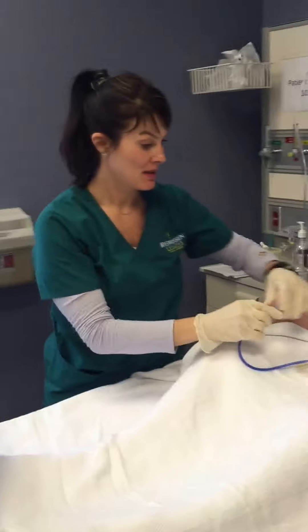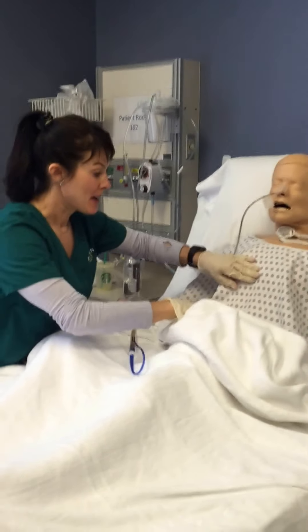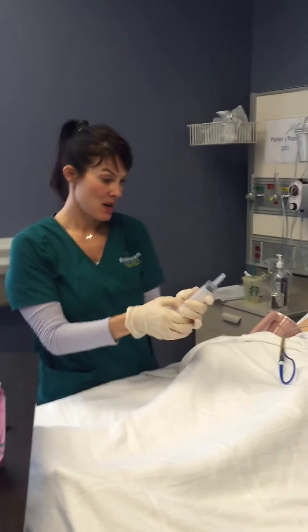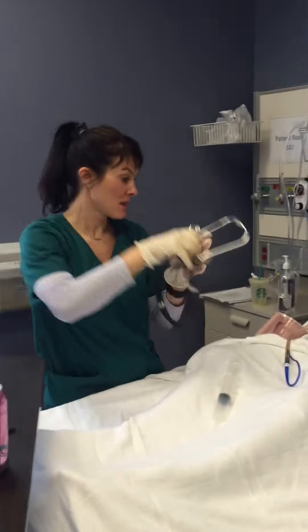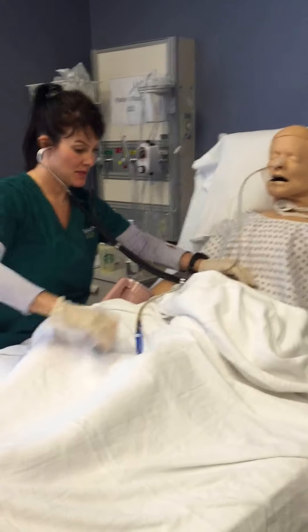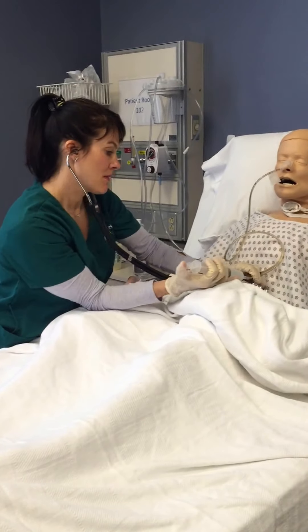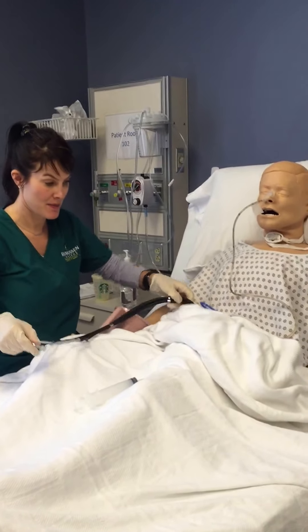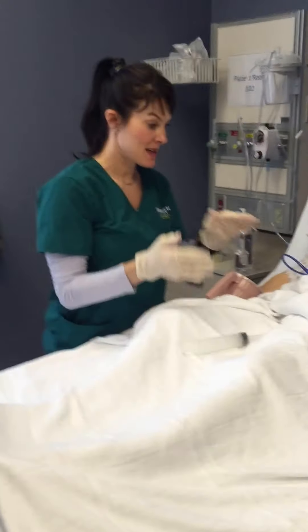After I do that, I'll put this back. X-ray is coming — they're going to take an X-ray to confirm proper placement. Then I'm going to insert about 30 mLs of air and listen for gastric sounds. On three — one, two, three. I'm in. Now I'm going to move to my next scenario because I need to feed my patient.